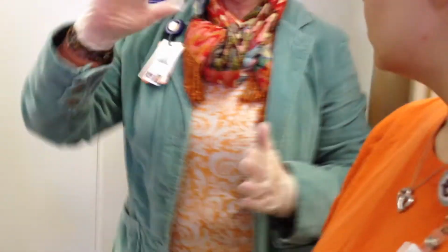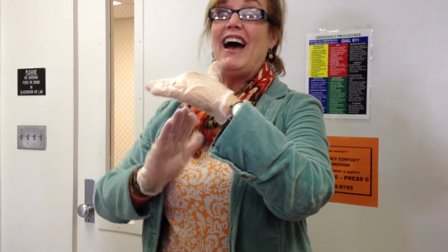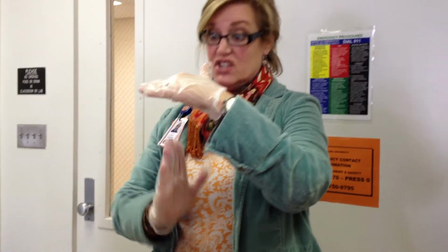You withdraw, and then when you let go of that skin, you're displacing it temporarily while you inject, and then you let it go. That skin's going to slide back over that injection site, and instead of having one direct puncture site down into the muscle where the medicine could go straight back out of that puncture site, kind of like a volcano does, it's going to have to find its way up, and then over, and then up and out. So it's very unlikely that medication will try to find that path of resistance. It's going to just stay right down in here.